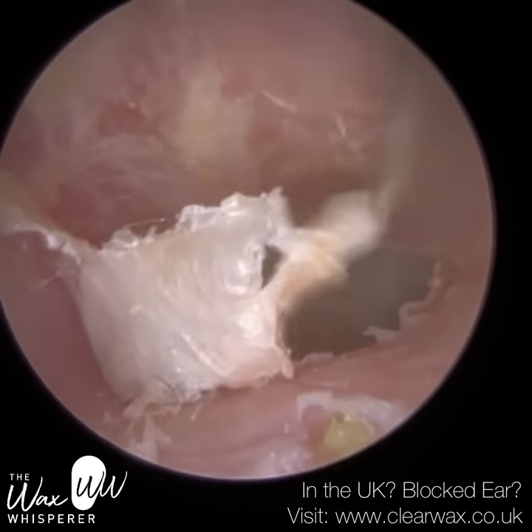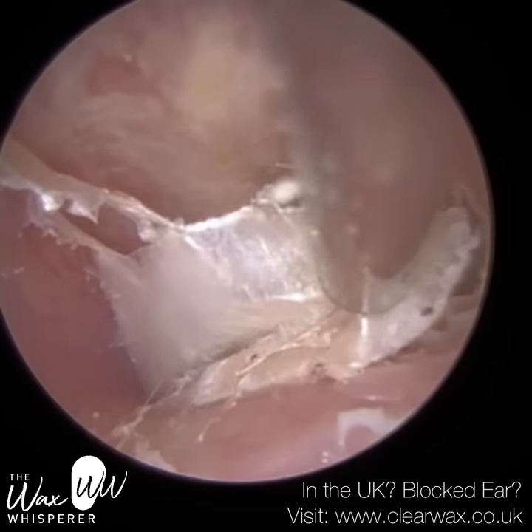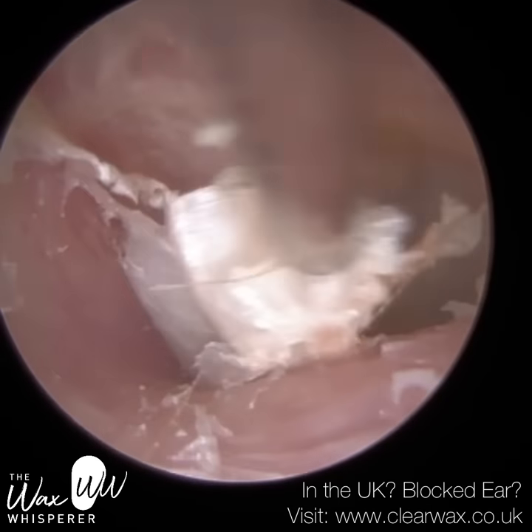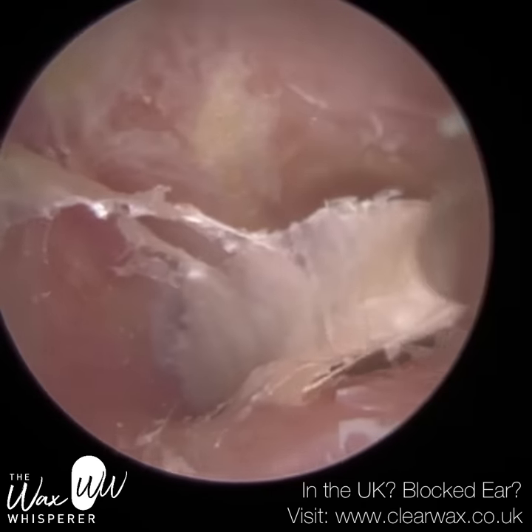I'm just using the fine end now to peel away the anterior layer of skin. You can see that I've removed a lot of skin already. We've used the forceps, and underneath is a nice, healthier-looking ear canal.